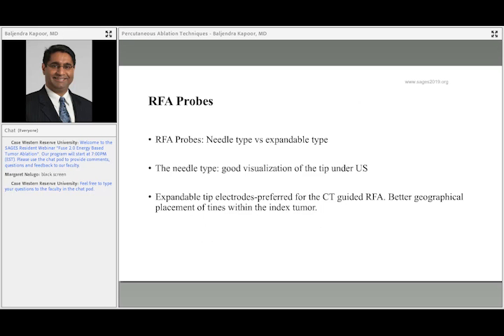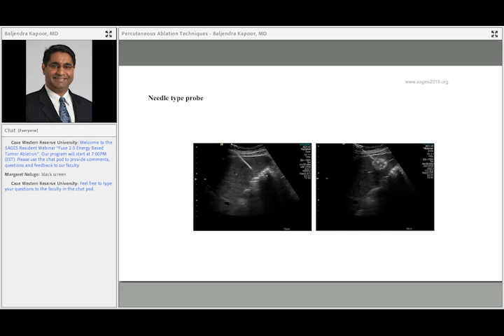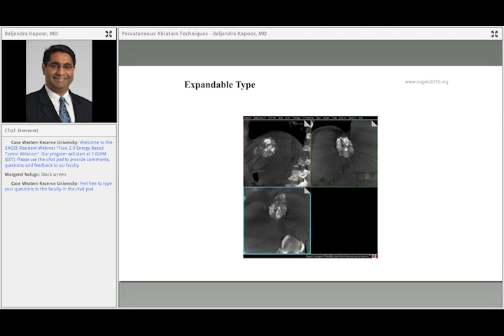Now, there are different kinds of probes. There could be needle type versus expandable type. Expandable is the kind of umbrella type. I'll show you that. The needle type is good for visualization of the tip under ultrasound. Expandable tip electrodes are preferred for CT-guided RFA. Obviously, they give the larger volume also, and it provides better placement of the tines within the tumor, since you can see it better. So here is your needle type probe under ultrasound. And this is an example of your expandable type of probe within the liver after chemoembolization for treatment of the residual tumor.